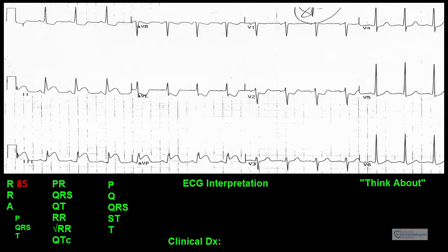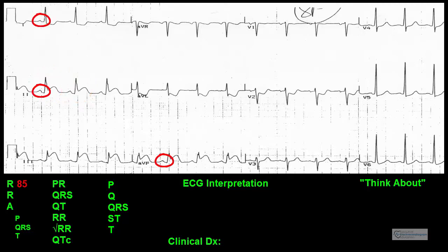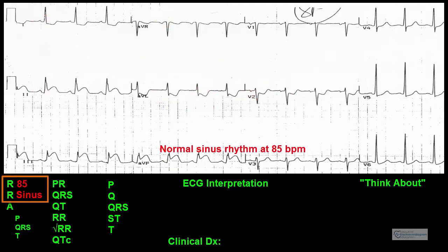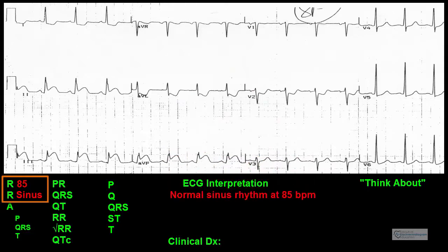Rhythm: There are regular P waves that are followed by QRS complexes. The P waves are upright in leads 1, 2, and AVF, and inverted in lead AVR, suggesting a sinus rhythm. Since the rate is between 60 and 100 beats per minute, we can list normal sinus rhythm in the ECG diagnosis section.